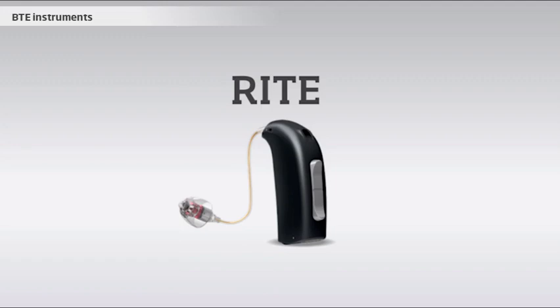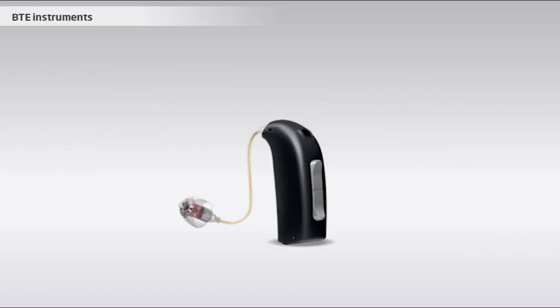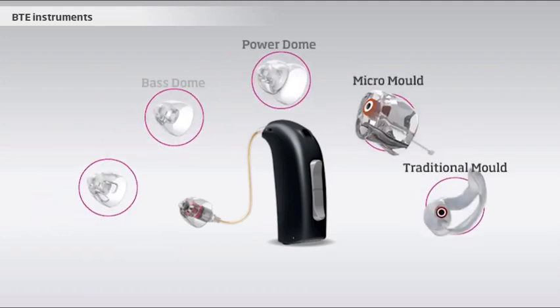However, in some cases, if the user has very narrow ear canals, or produces a lot of ear wax or sweat, it will not be possible to use a RITE instrument. Different ear molds and domes are available for the BTE and RITE solutions. They range from tight, custom-made ear molds that take up a lot of space in the outer ear and ear canal, to small standard domes, which almost disappear in the ear canal.